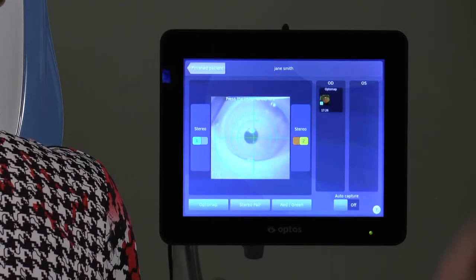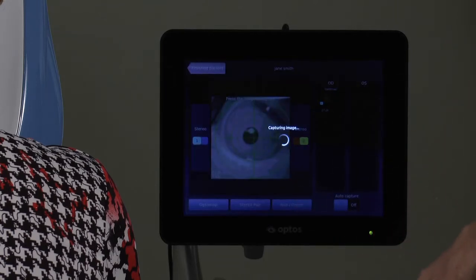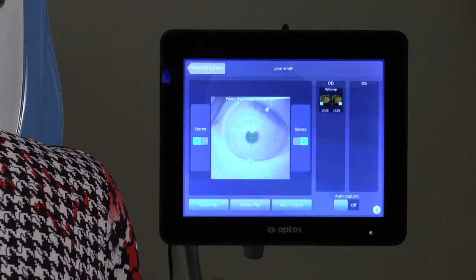Next, click on the Stereo 2 Imaging button, which moves the crosshairs right of center. You must capture both Stereo 1 and Stereo 2 images to complete the pair. You can capture on-axis images when both stereo buttons are inactive.